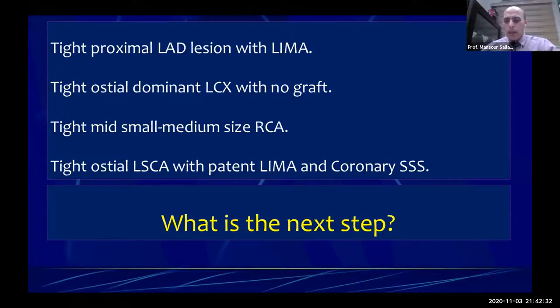Okay, so my approach, my rationale, to be frank with you, right now, the patient is having severe angina, even angina at risk. The patient is on the table right now. And there is jeopardy of the myocardium at the level of the LCX, which appears a very large vessel. So what is in my hand right now to do is LCX. RCA, I think there is a question mark about its size. Does it require intervention or not? But definitely LCX is considered to be the main target for me right now.